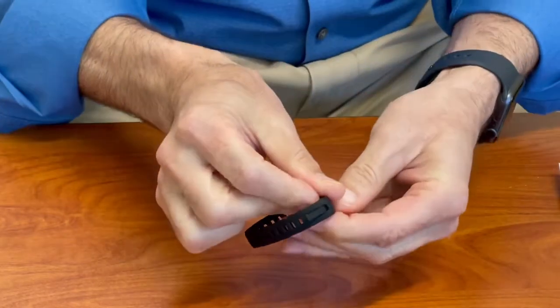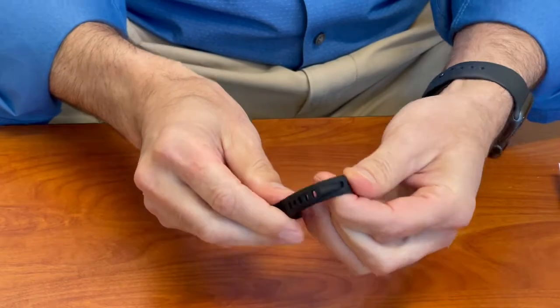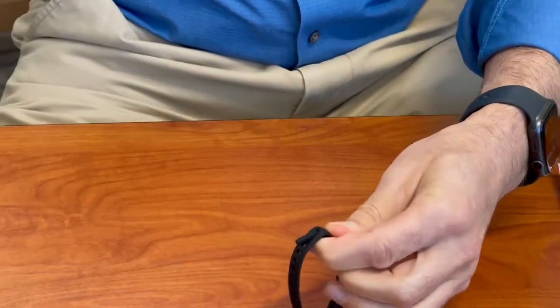Then when you're comfortable with that sizing, you lock the tab. So the tab is now sticking through.